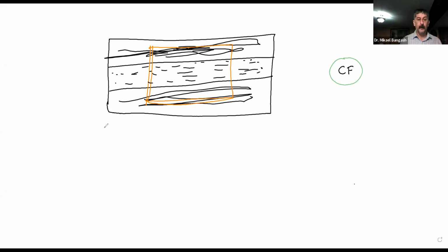Now, although we turn on the color mode, we may still not see any colors within the blood vessel at this point. And the question just arises, why is that? Once you know why, then you can always do something about it.